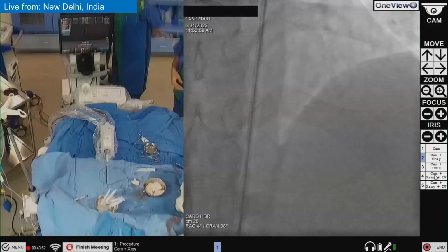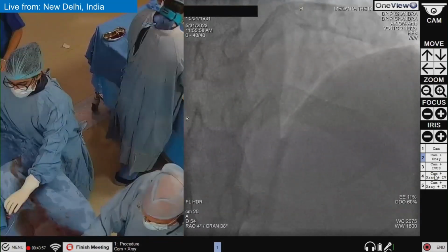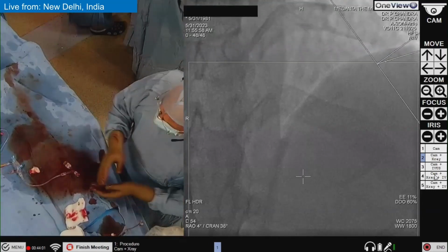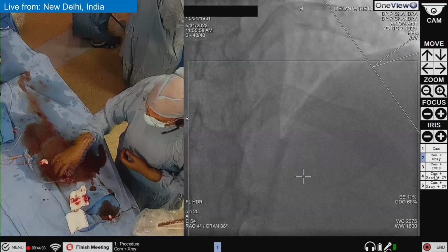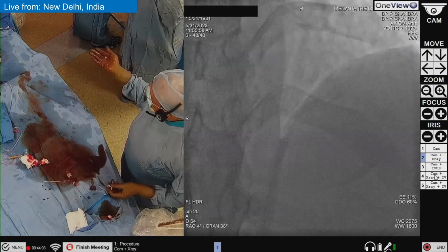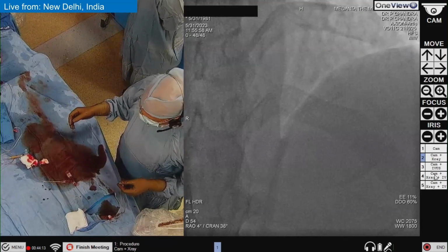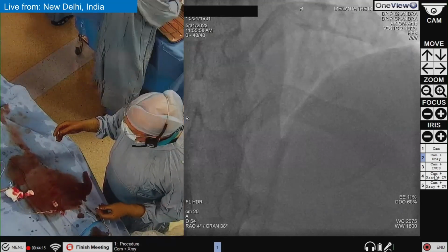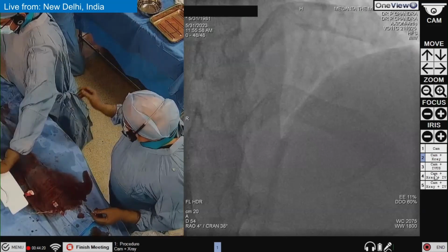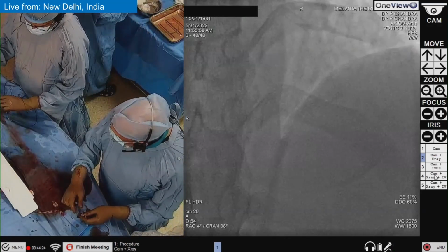And now I'm taking the right catheter, RCA guiding. This is just to emphasize that even in multi-vessel PCI, we can do this. Also send an ACT. Let me have the ACT syringe, please. One more wire, BMW.